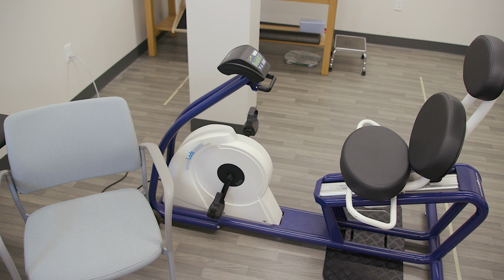The examiner should also be aware of postural and structural changes such as slouching or head leaning. Noting the patient's thoracic and cervical posture may offer clues on the etiology of the injury. Here are the supplies you will need to perform the Buffalo Concussion Bike Test.